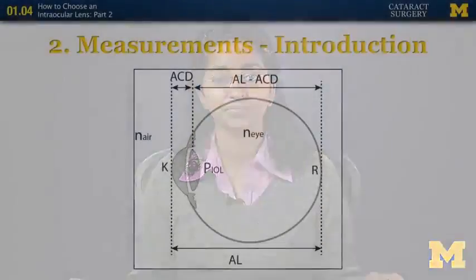This complication happens to be one of the more common malpractice claims for ophthalmology. We use different safety checkpoints to avoid this error, including marking the eye, timeouts, and having only one patient's information or IOL in the OR at a time. The starting point to verify correct information is your calc sheet, so train your brain to always first assess the identifying data before moving on to looking at the numbers.